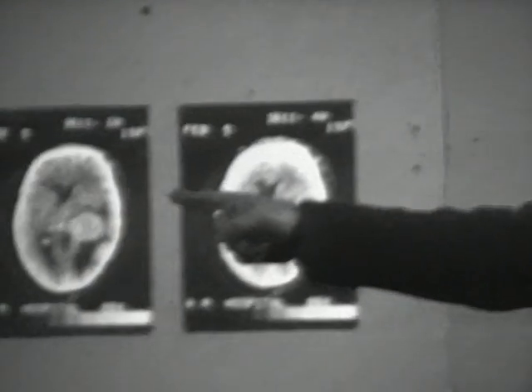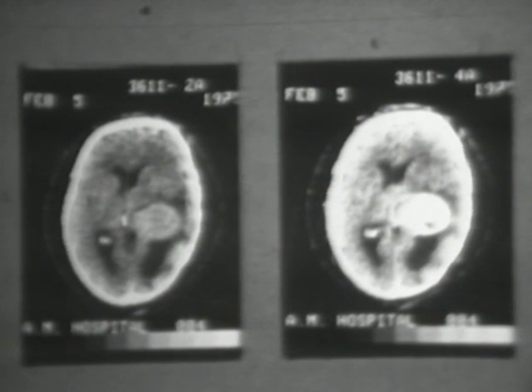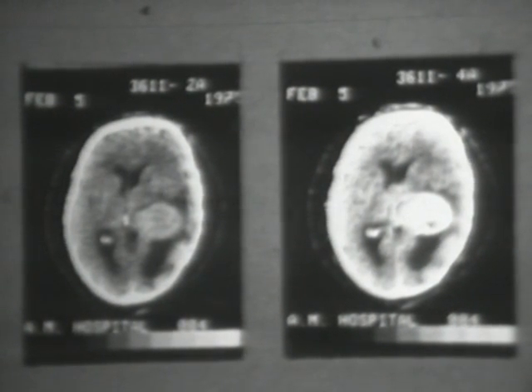It requires no great stretch of the imagination to see that what we have required for a long time now is a system which would enable us to look at the structure of the brain without causing the patient fear or discomfort. This is the EMI scan of the patient whose skull X-rays and technetium brain scan we have been looking at.